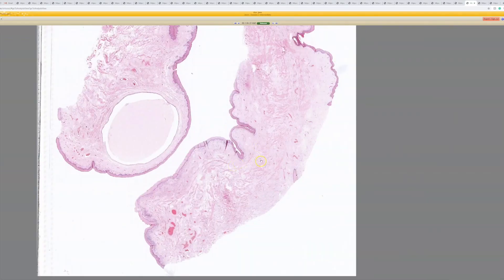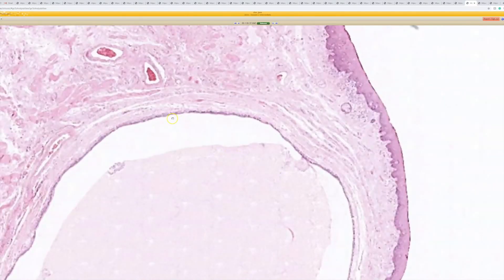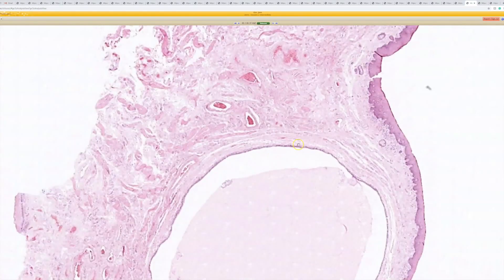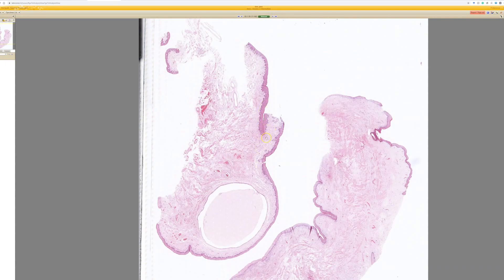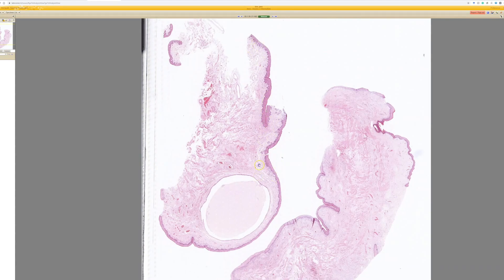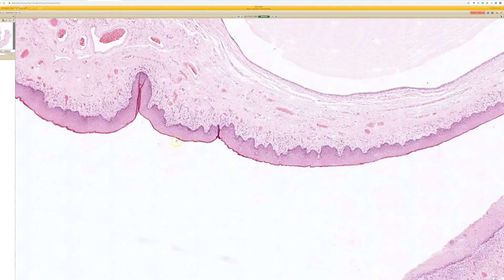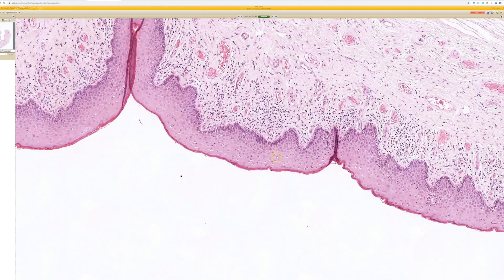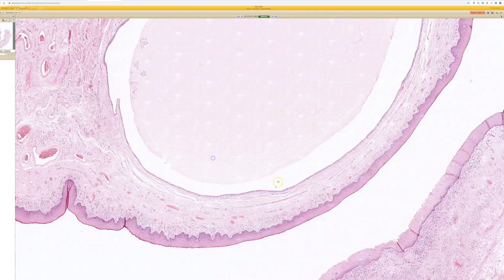This is somewhat similar to the last one with a bunch of squamous muscle on those, suggesting genital skin cells — median raphe cyst. This looks kind of like skin out here, but as you get over to this side you can tell that it's actually stratified squamous epithelium with a pale kind of cytoplasm and no granular layer, so this is squamous mucosa.